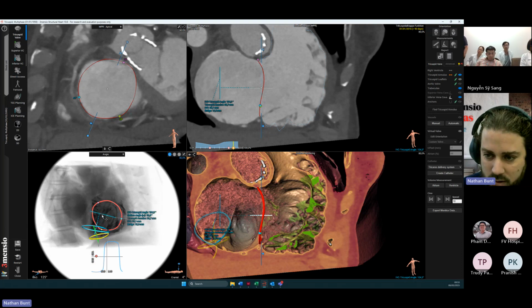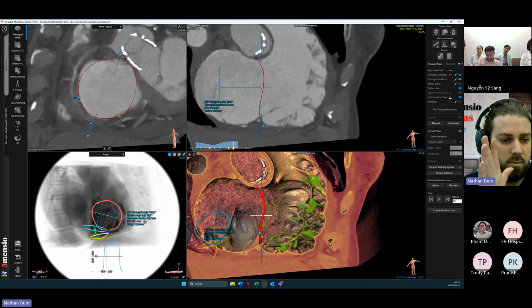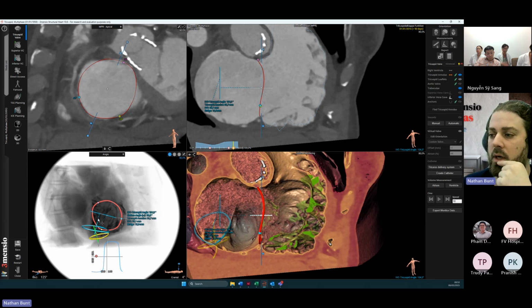And there you can see that this distance, which is mentioned as the bridge distance, is the offset between the two. For this particular case, we see that the inferior vena cava is somewhat septal hugging, which is for crossing the valve plane actually quite a good thing, because there's also less trabeculations in this patient.